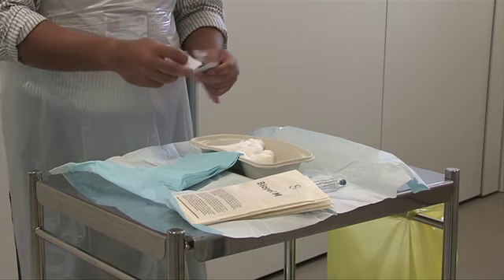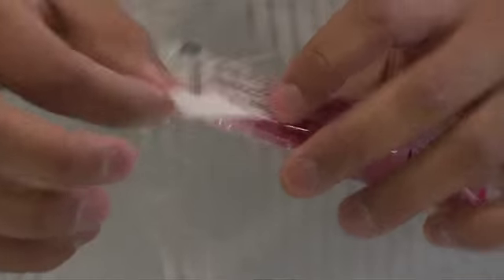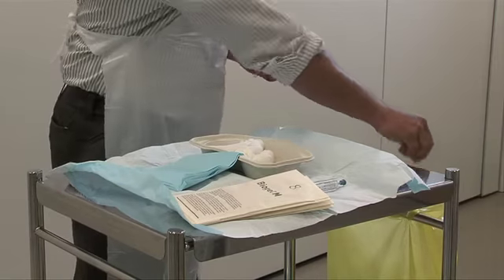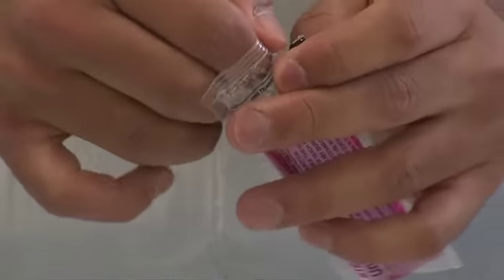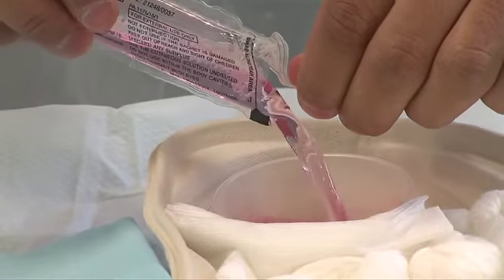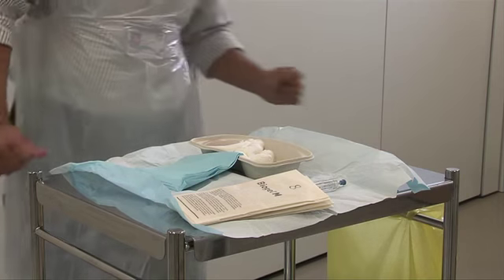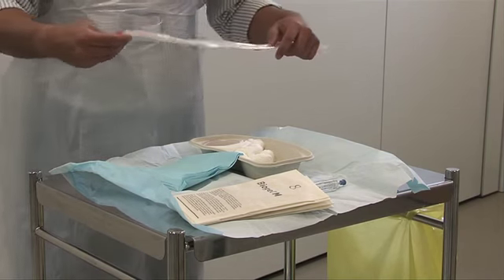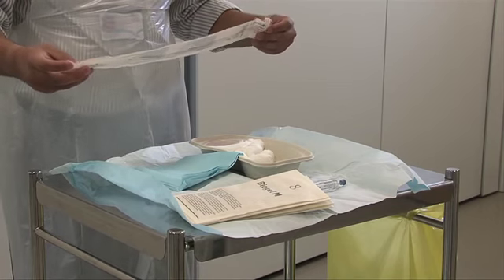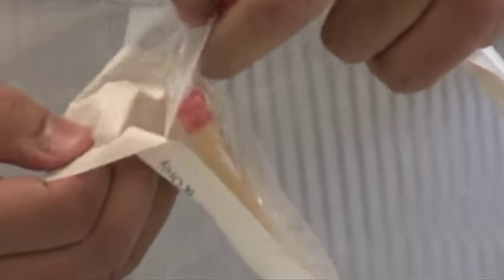Using an alcohol wipe, cleanse the opening of the antiseptic solution and pour it into the container. Using a non-touch technique, remove the catheter from its packaging and place it onto the equipment trolley.